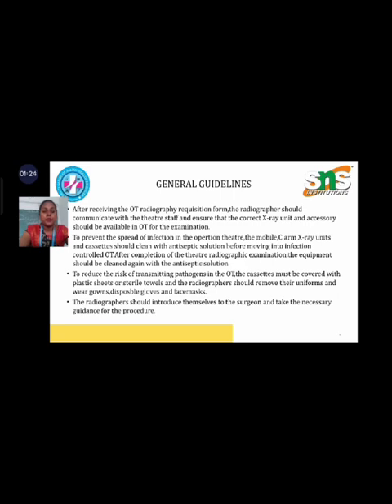To prevent the spread of infection in the operation theatre, the mobile, C-arm X-ray units and cassette should be cleaned with antiseptic solution before moving into infection-controlled OT. After completion of the theatre radiographic examination, the equipment should be cleaned again with the antiseptic solution.